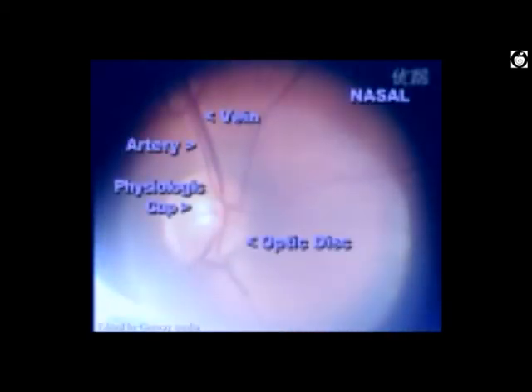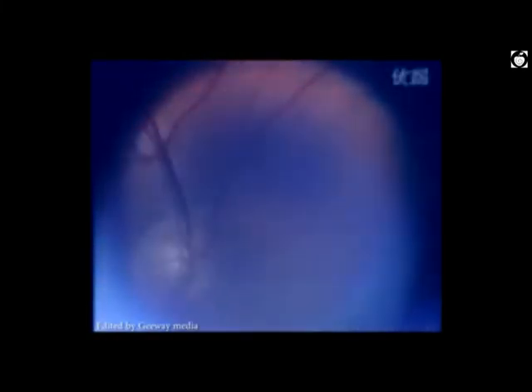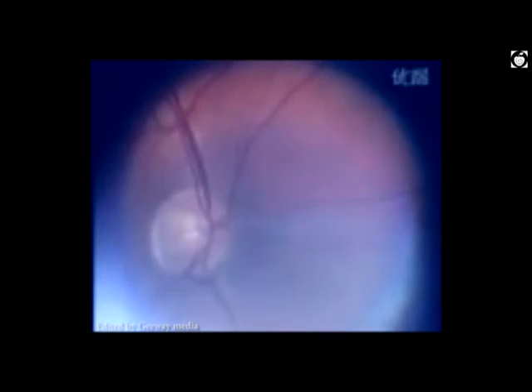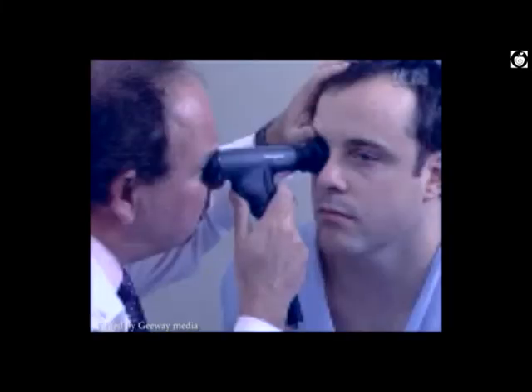The cup is the portion of the disc that is central, lighter in color, and penetrated by the retinal vessels. The normal ratio of the cup to disc diameter varies from 0.1 to 0.5. The examiner should check the cup to disc ratio in both eyes for symmetry.